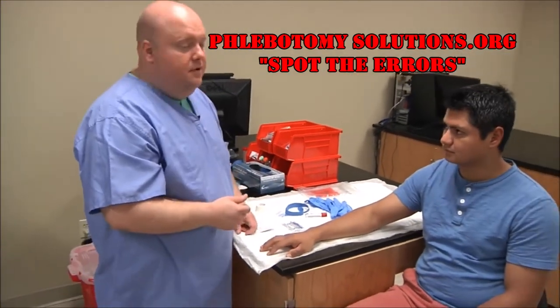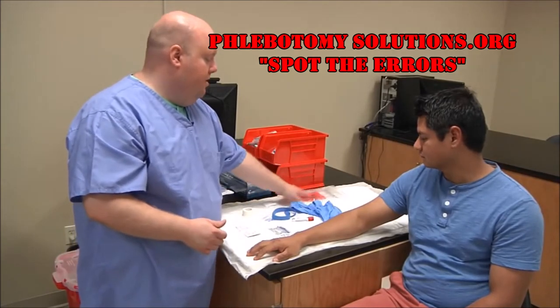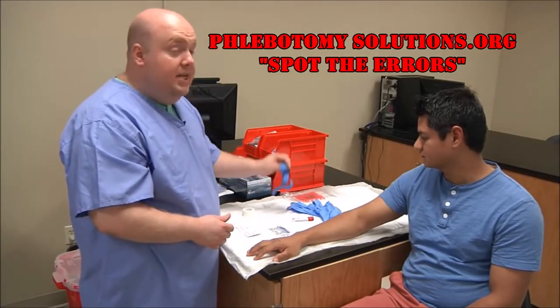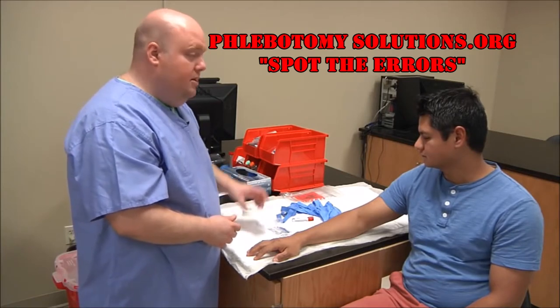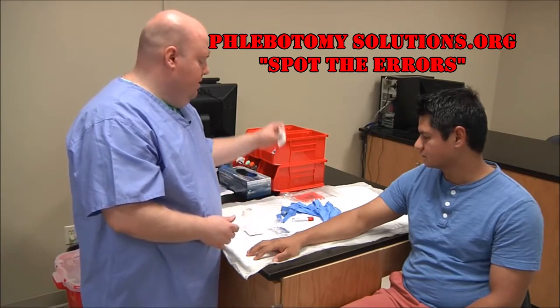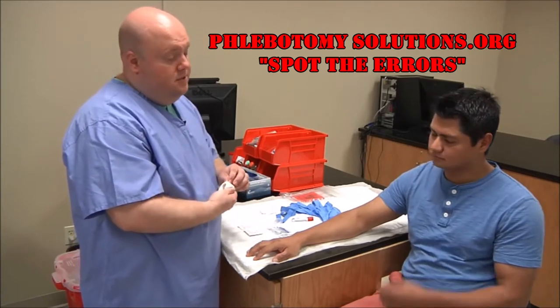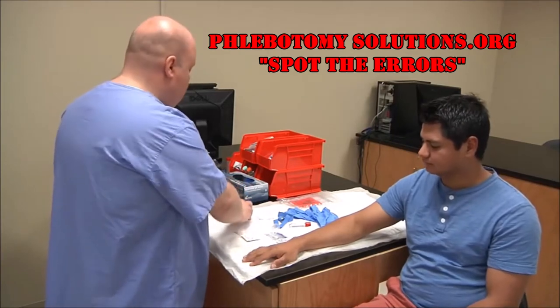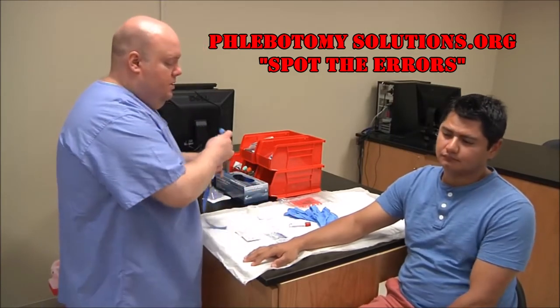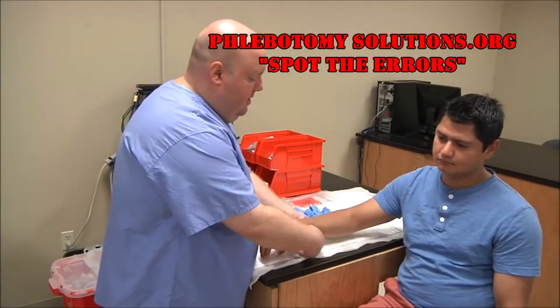I've already asked the patient for consent and he's given me consent. I've gathered all my supplies: gloves, biohazard bag, clean tourniquet, a holder for my winged collection set, alcohol pads, gauze, and tape. One of the things you want to do is pull off a piece of tape and put an edge on the corner, then begin to look and palpate.